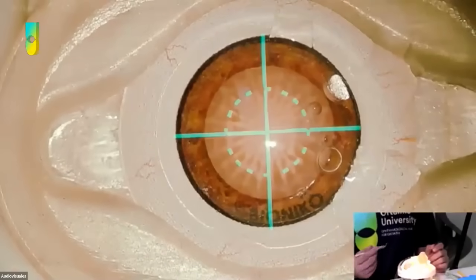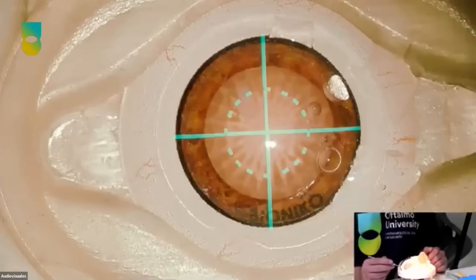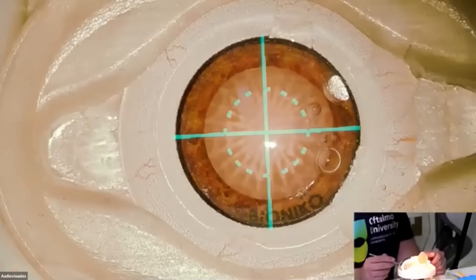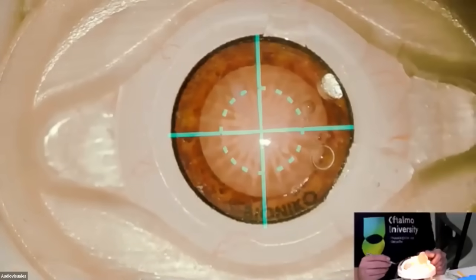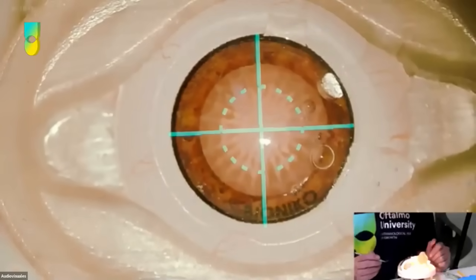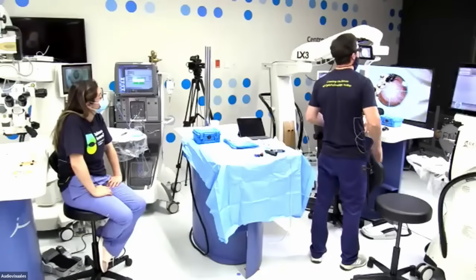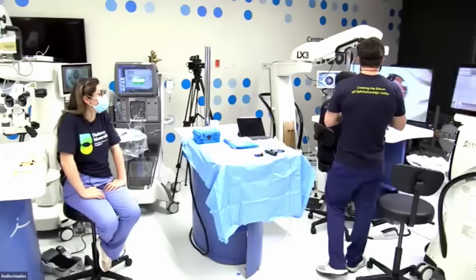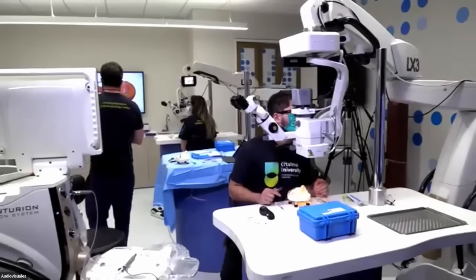I love it, Cecilia. And if you really think about it, when you're comfortable with the human eye doing clockwise, you will not go counterclockwise. I have seen that so many times. But if you have a simulation environment, then you can try, right? This is one of the powers of simulation. I think this is something we need to talk about: fidelity, how these eyes behave. If you can learn from them, you can learn so much that it's very, very important. You're also in an environment where we can communicate, be with each other, talk, and do that task many, many times.